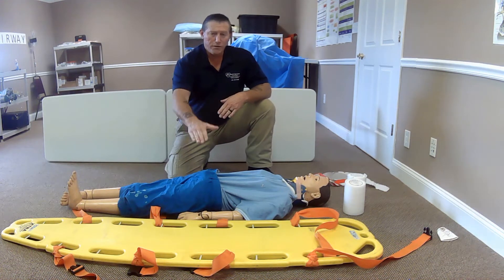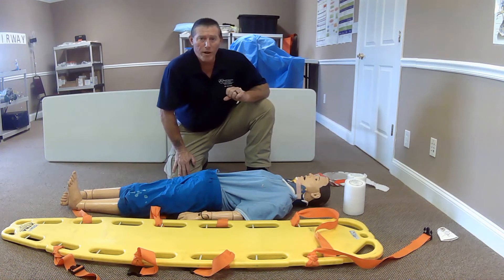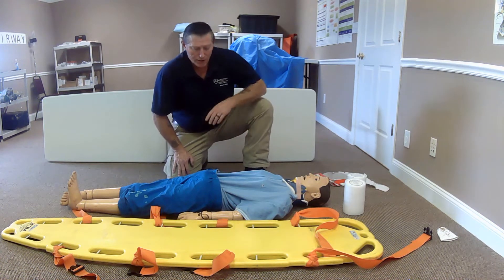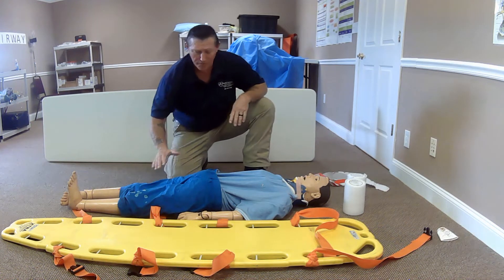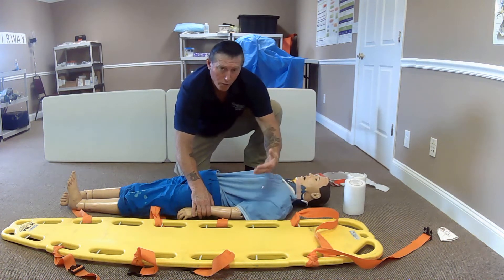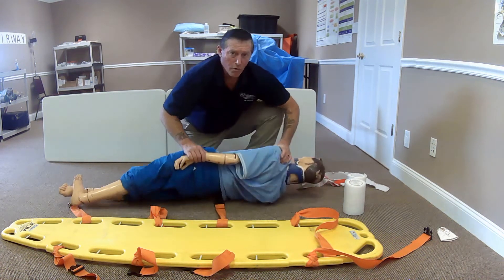We are now going to move our patient to the long spine board. We're never going to move our patient without the direction and counting of the head person — whoever is at the head is in charge of this patient. With my two EMT assistants, one at the head and one at the feet, I'm going to grab the hip and shoulder area. On the head person's count of three, we're going to rotate the patient up.